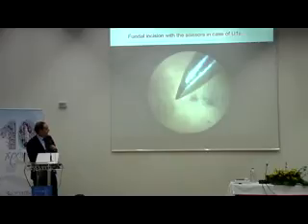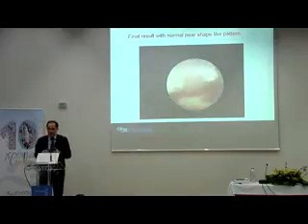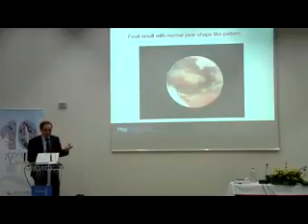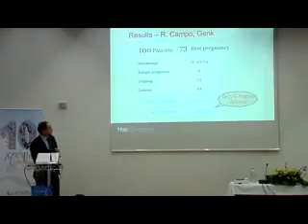And the aim of this surgery is to get the ostium a straight line to the other side, a straight line downwards, and here we have the anatomical proof of a normal uterus. Now, is this a game? Should we do this? Are we helping the clinic director to earn a little bit more money? Or do we have something which we should treat?